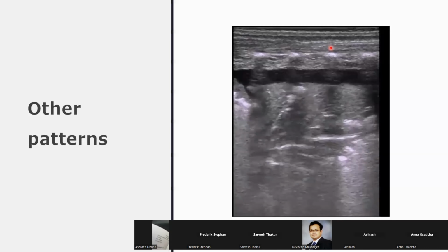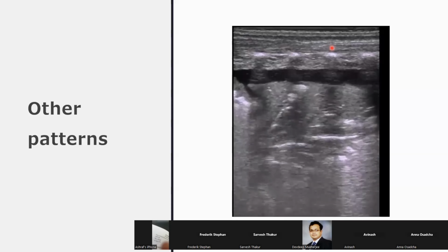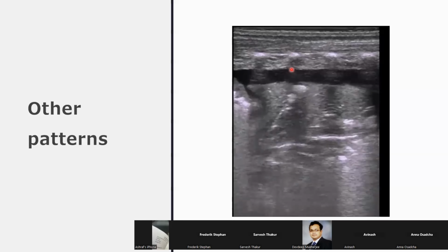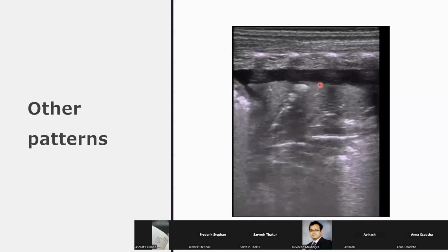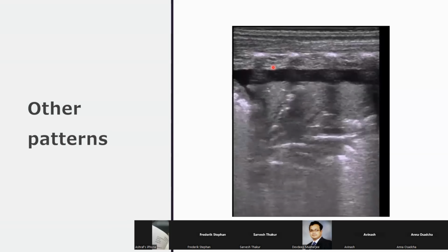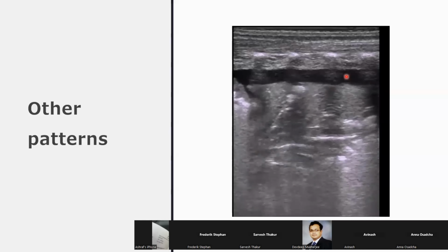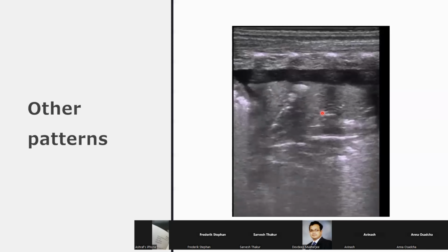But I can see like below the ribs, I can see the black area, which generally. Very good. What is that? Pleural effusion. Very good. Pleural effusion. Okay, see, pleural effusion. So this is lung. Okay, that's parietal, that's visceral pleura. Now, do you want to describe the profile?